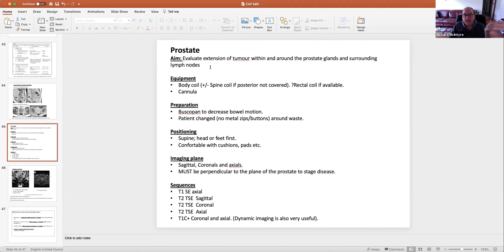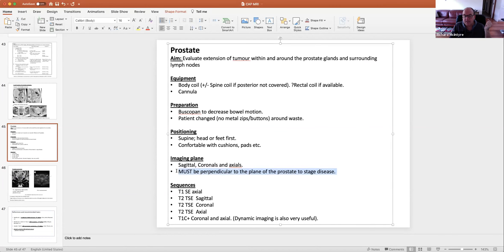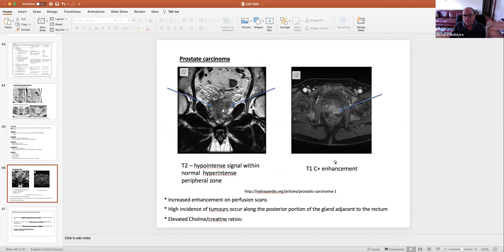Lastly, the prostate: evaluation of extension in and around the prostate gland. Scanning must be perpendicular to the plane of the prostate to stage disease — that's most important. We do T1 and T2 scans and give contrast. On T2, a tumour shows as a hypo-intense signal within the normally hyper-intense peripheral zone. That hypo-intense signal is enhanced on post-contrast imaging.